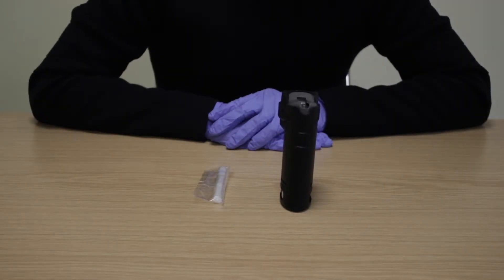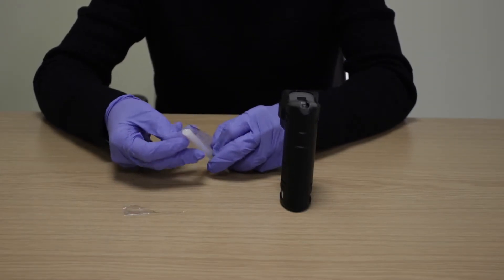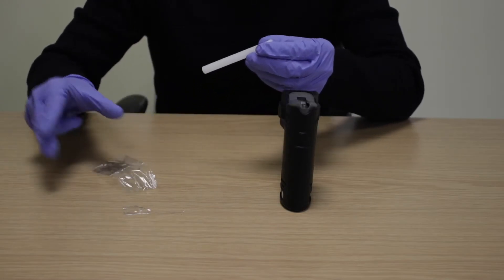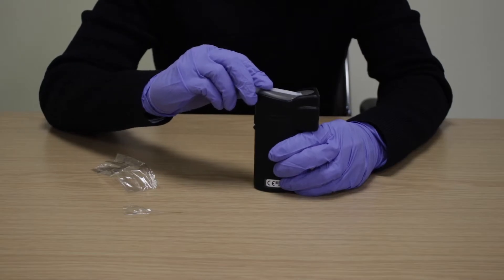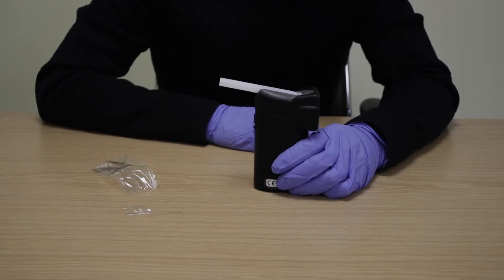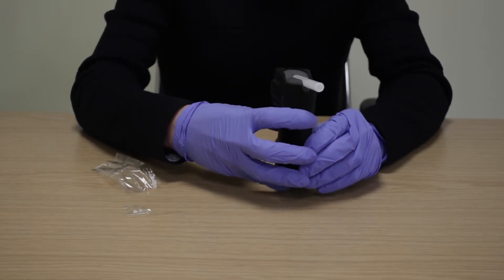To start a direct test, always use a new mouthpiece. Remove a mouthpiece from its protective wrapper and place it onto the top of the device. Ensure the mouthpiece snaps firmly into place before starting a test. With the mouthpiece firmly in place, turn on the device by pressing the on button with your index trigger finger for one second.